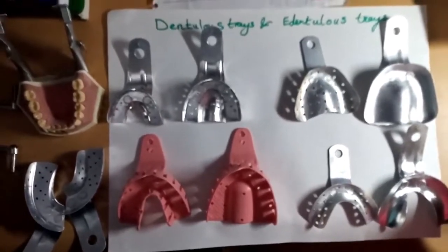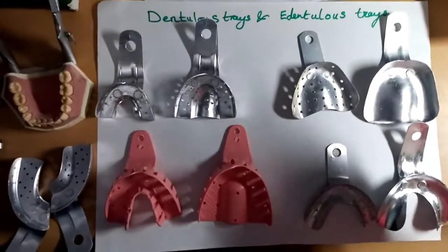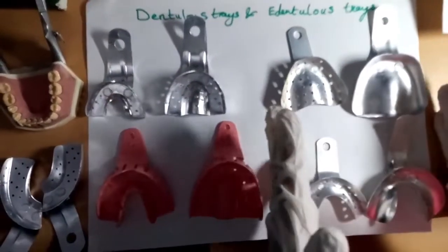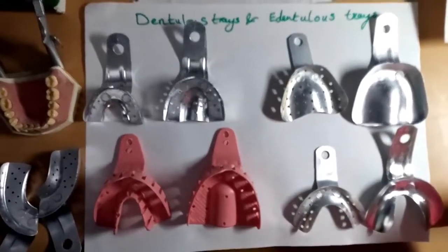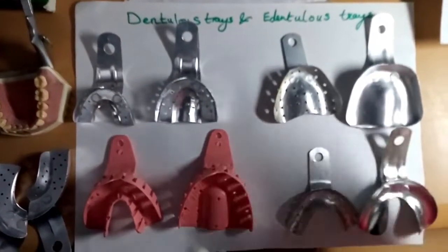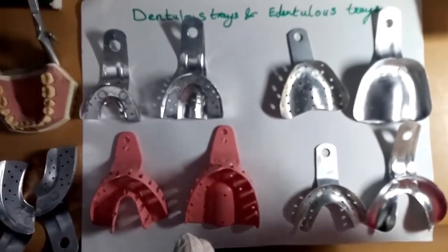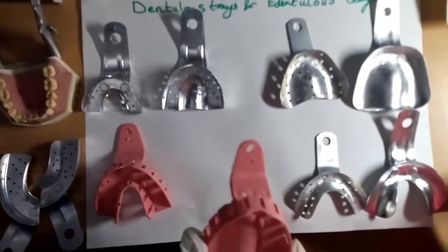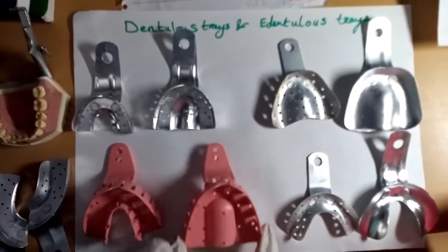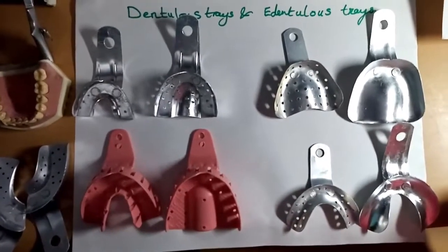So this is the third classification. Then it could be classified into metallic and non-metallic. Can you see, these are made of metals? It could be made of aluminium or stainless steel, and this is the metallic part. And it could be made of non-metallic impression trays, like plastic. This is non-metallic, made of plastic, and normally this plastic is disposable.